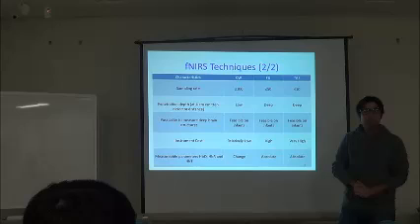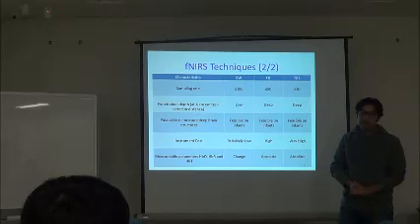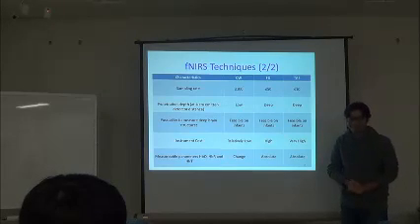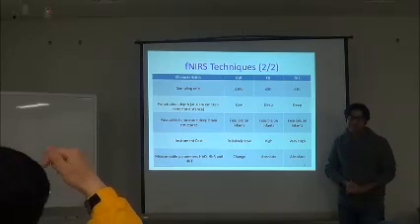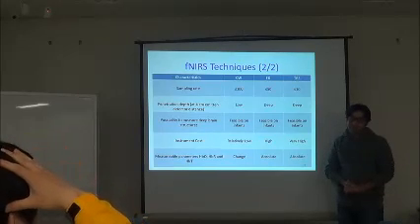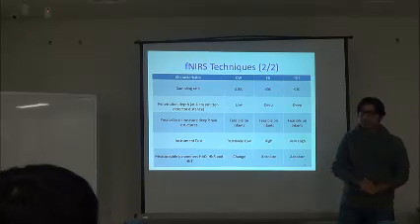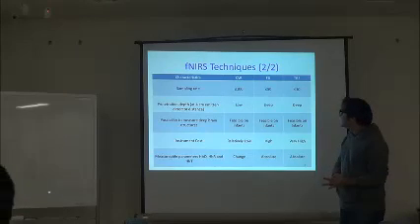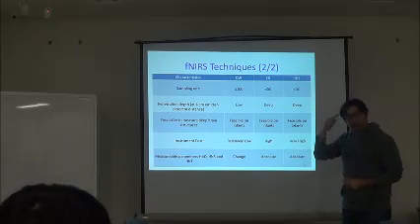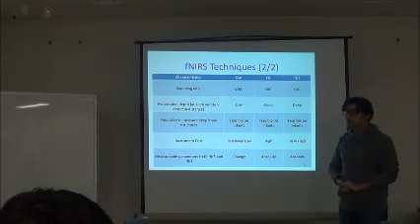The speed of photon is same as the speed of light. True. As I know, the speed of light is very very fast. So in the case of the distance of this range of brain, I got you. There is another thing. Yeah. First of all, it does not travel straight. It has to go through multiple scattering. But even then, it should not be that slow.